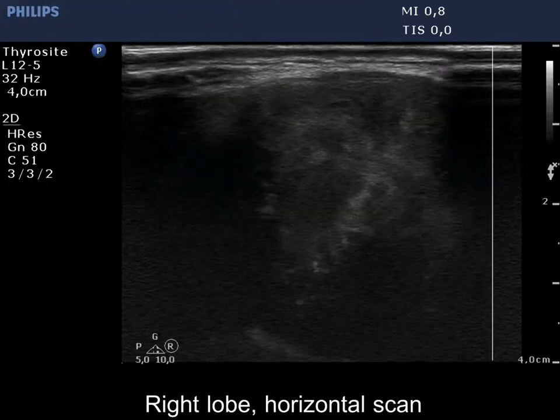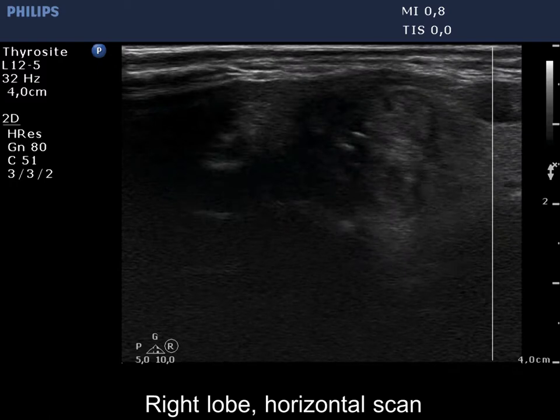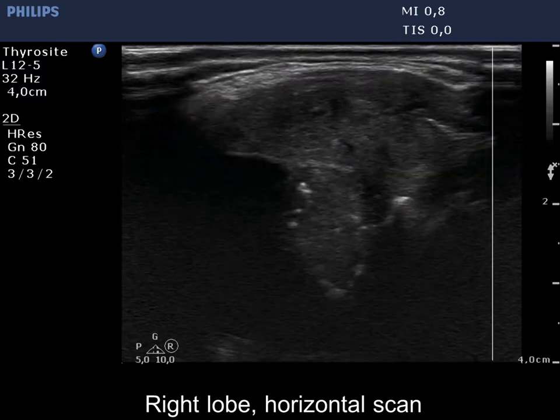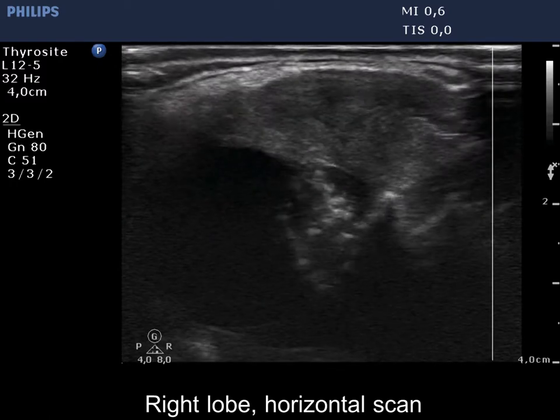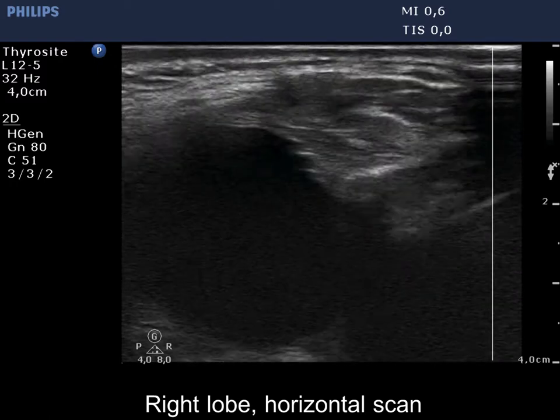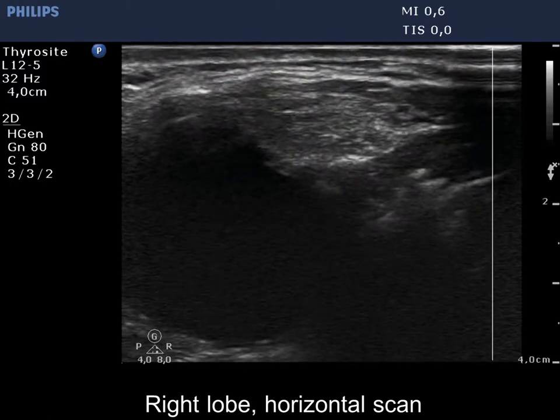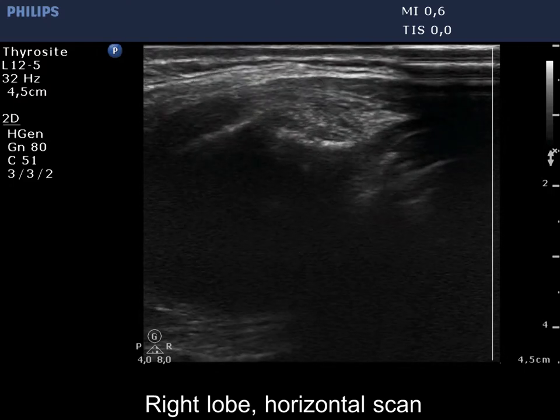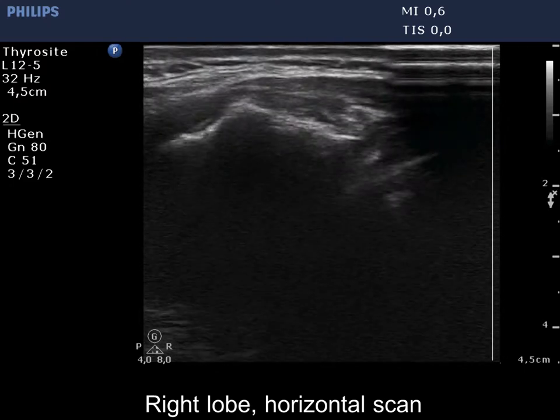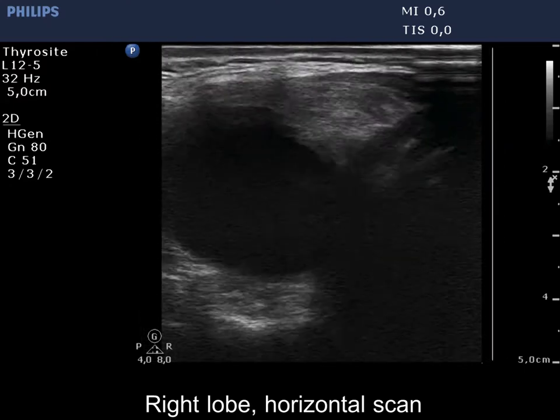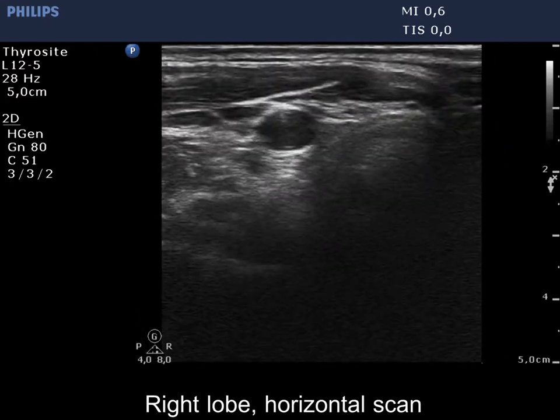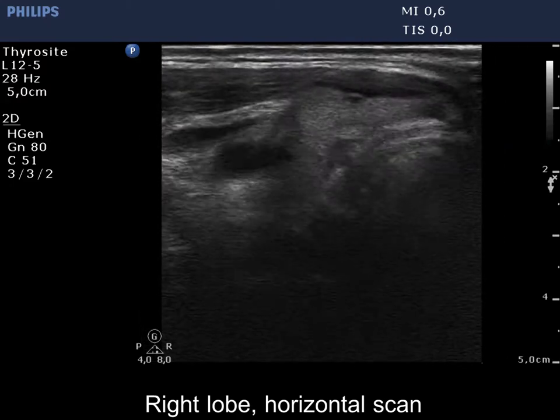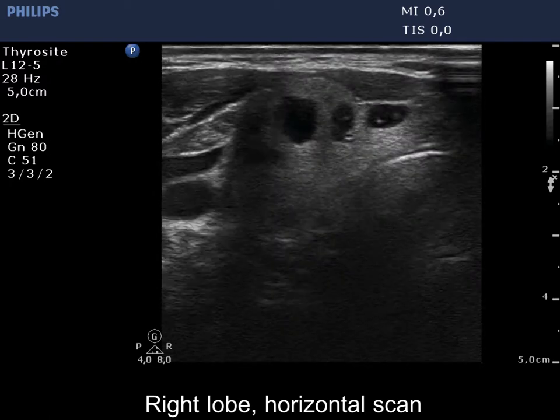A large cystic lesion occupies almost the entire right lobe. We had to reset both the depth and the focus in order to achieve better visualization.